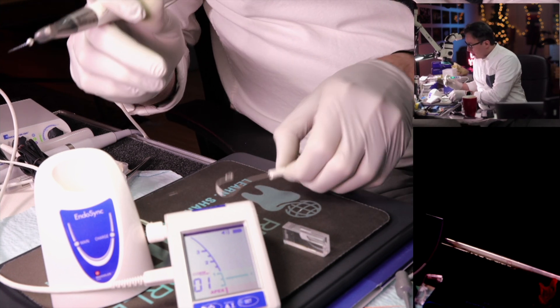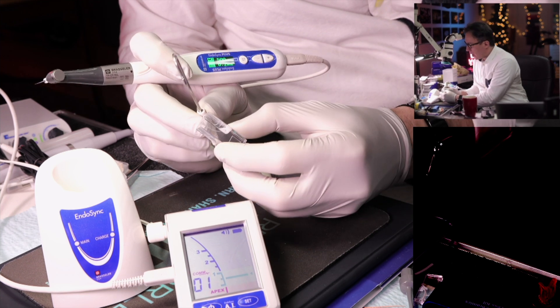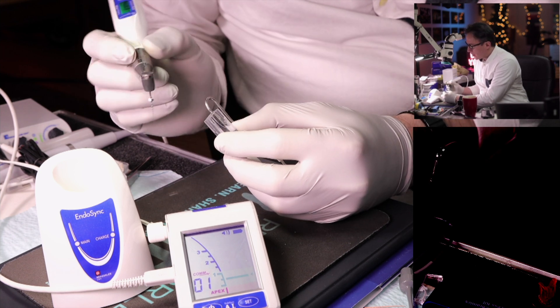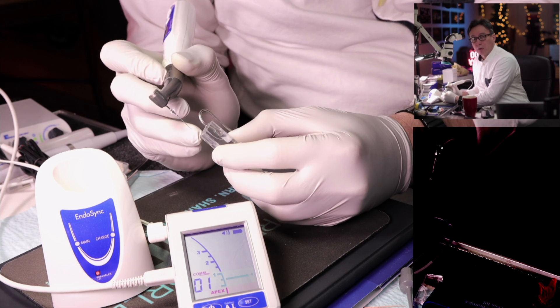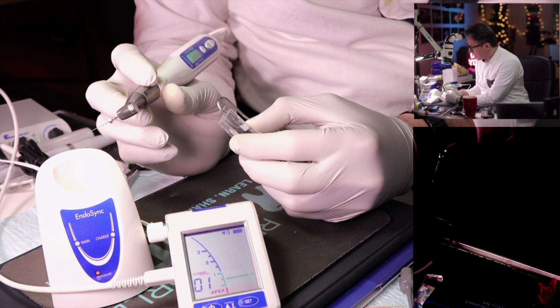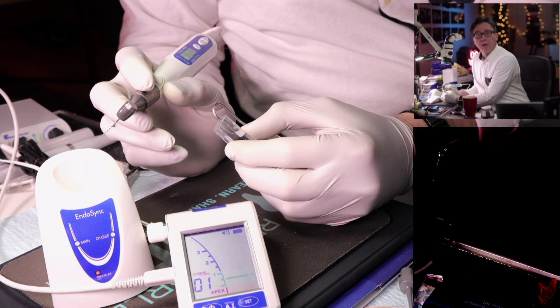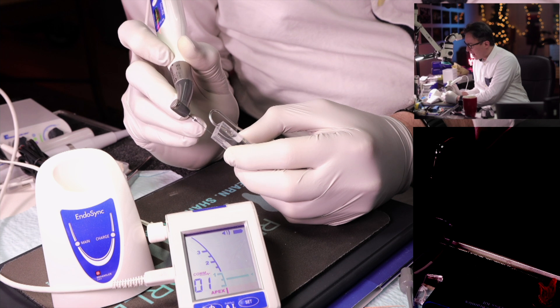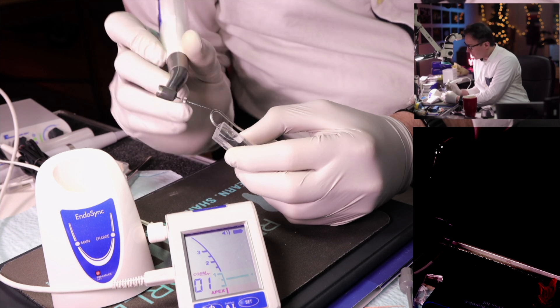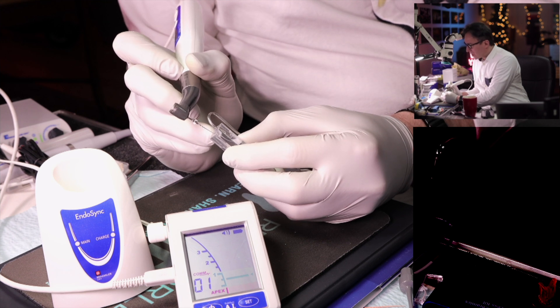Now with this dummy block representing a root canal, the lip clip simulating placement on the patient's lip, we can see what happens as we introduce the file into the canal. There are several settings available: you can activate the automatic start/stop, so the file starts rotating when placed in the canal and stops when removed.